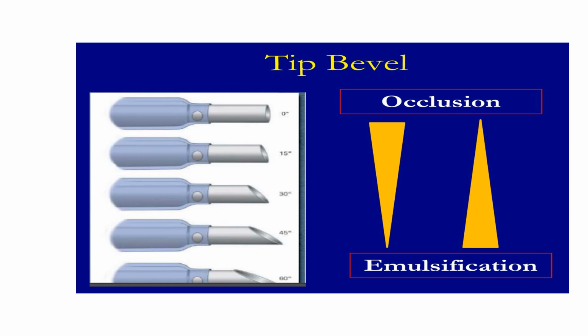The adult, because his mouth opening is bigger, will have a greater holding force, and the child, because his mouth opening is lower, needs to suck harder to compensate. So if we talk of cutting ability now, we have to understand how the degrees of bevel, that is the surface area of the bevel, has an impact on the cutting ability.